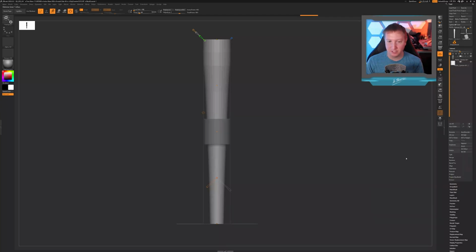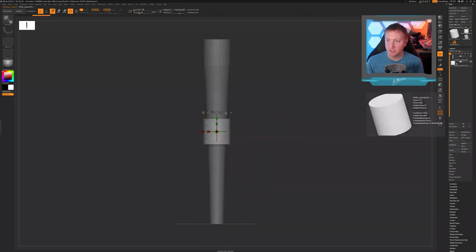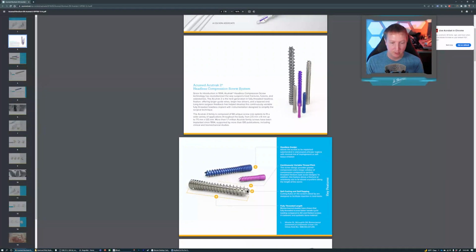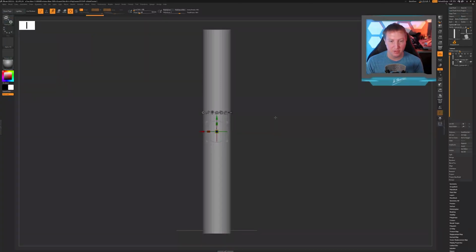So I'm going to add in another cylinder here. And similarly, I'm going to lengthen that. So I'm going to get out of my bend curve, select that tool, and lengthen it out to the length of the screw. And I want it to be just a little bit bigger. One thing that I forgot to mention is that in this Acutrack screw, notice that the threads are a consistent diameter across the whole screw. They don't taper the way the actual inner portion of the screw does. So we're just going to leave this cylinder its full width like this.